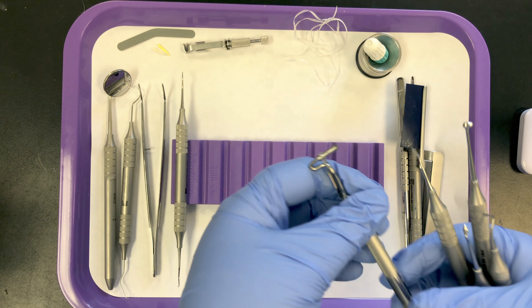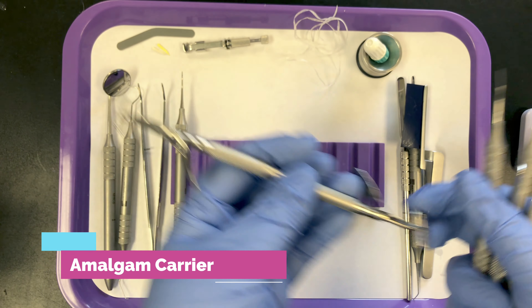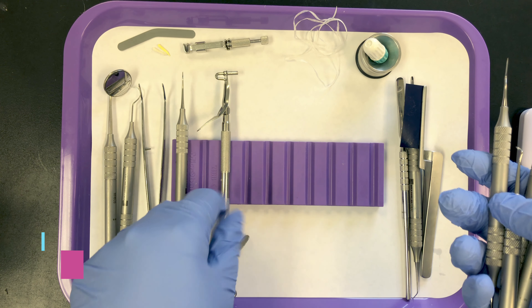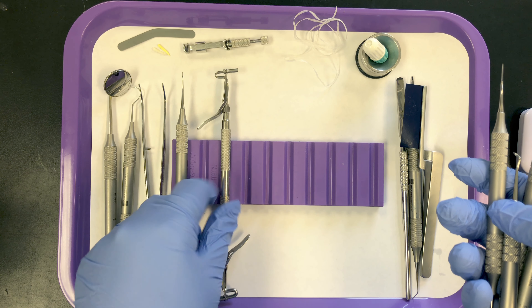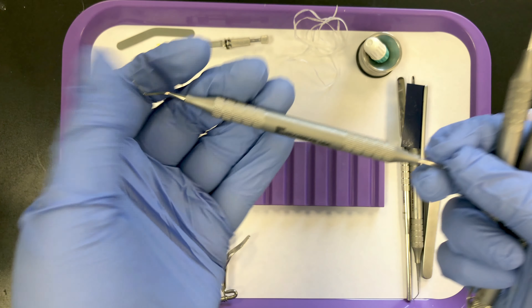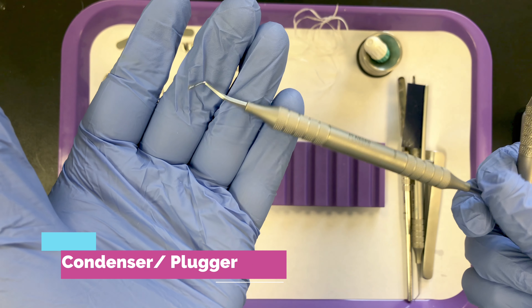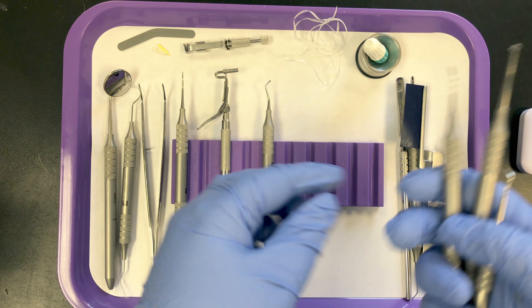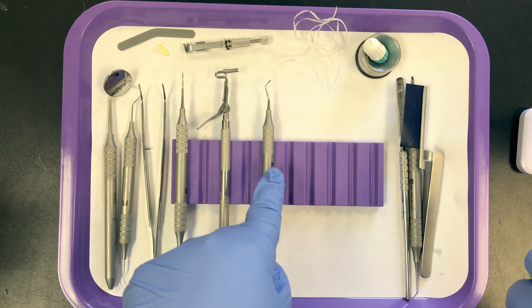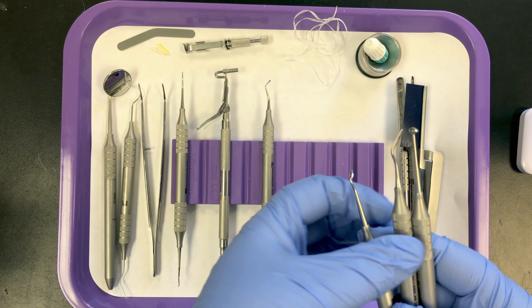Then we have our restorative instruments. Next, we have the amalgam carrier, which carries the amalgam to the preparation. We're responsible for filling this with amalgam and passing it to the doctor. Once the material is in the preparation, the doctor needs the condenser to pack or condense the amalgam into the preparation. During the procedure it's back and forth — carrier, condenser, carrier, condenser — until the filling is in place. The doctor overfills the preparation.